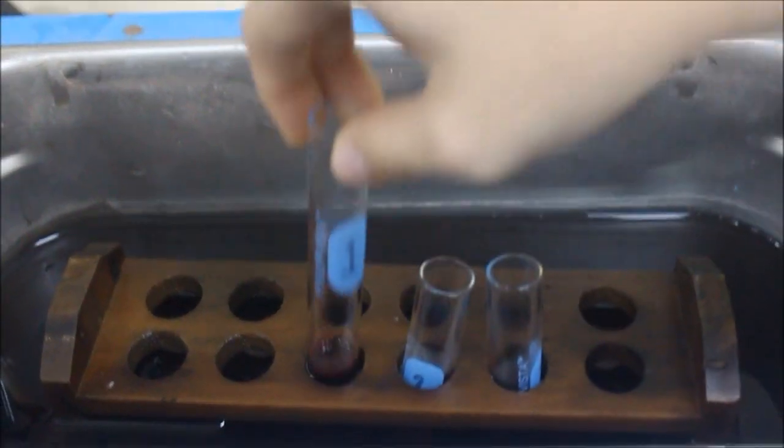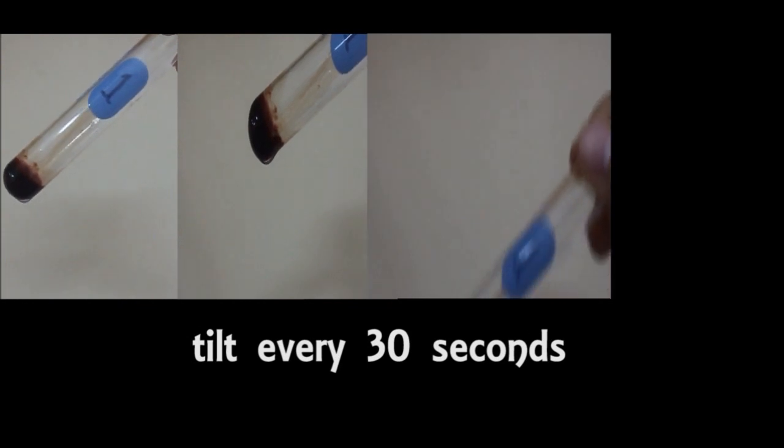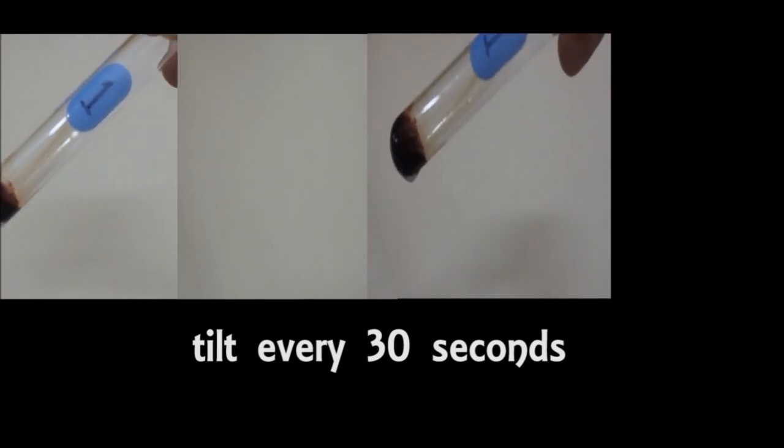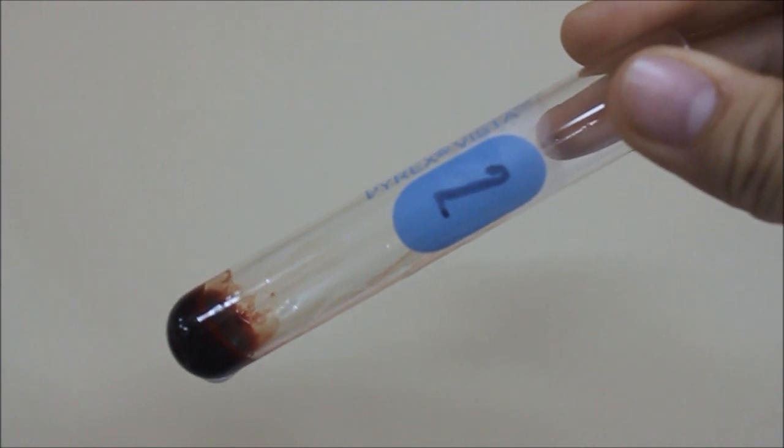At exactly 5 minutes, tilt test tube number 1 gently to a 45-degree angle. Repeat the procedure every 30 seconds until the test tube can be completely inverted without spilling the contents. Do the same in test tube number 2, then test tube number 3.